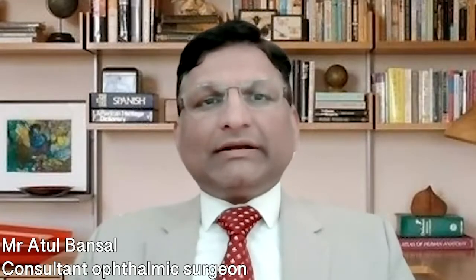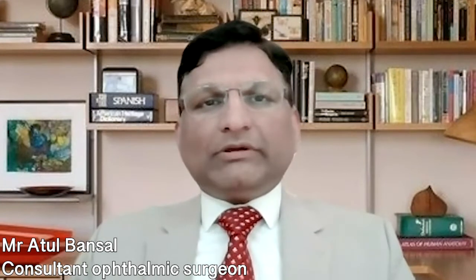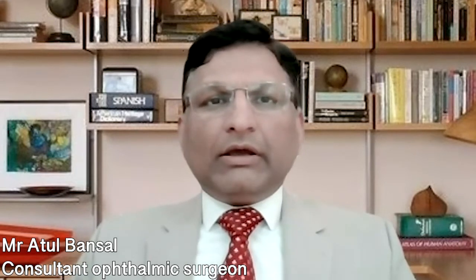The commonest that is used these days is selective laser trabeculoplasty. However, the techniques differ from case to case. The three commonest ones used are selective laser trabeculoplasty, YAG laser iridotomy, and cyclodiode.